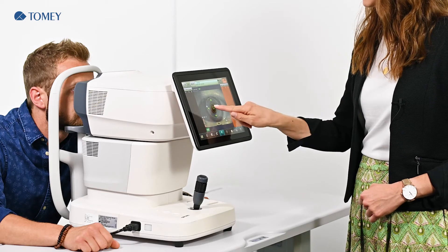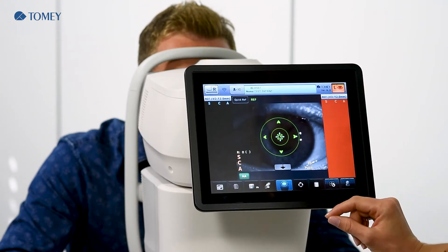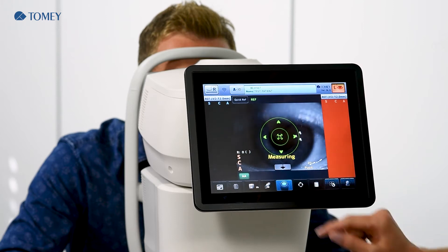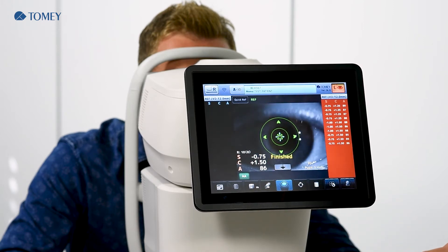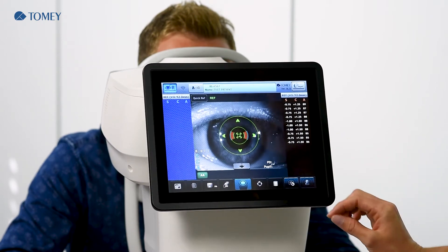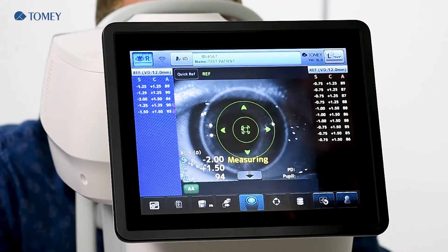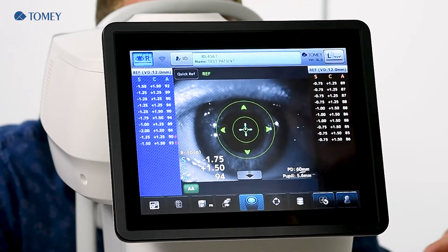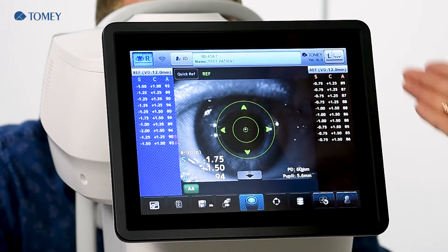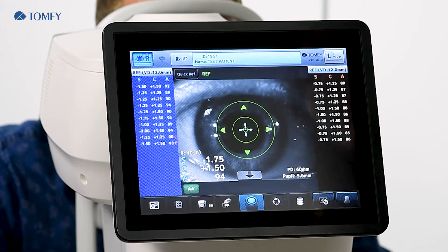Our patient will now pretend to be uncooperative and we will start the measurement. First, we have to go into the focus and touch a little bit in the display so you will see the blue cross. Now we are in focus and start the measurement. We then change to the right eye, get into the focus, and start the measurement again. You see we have some errors in these measurements, but at least we have a result and so we have a starting point for the next steps in the examination.